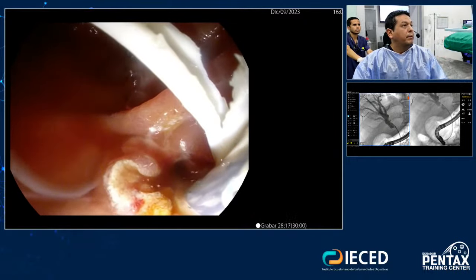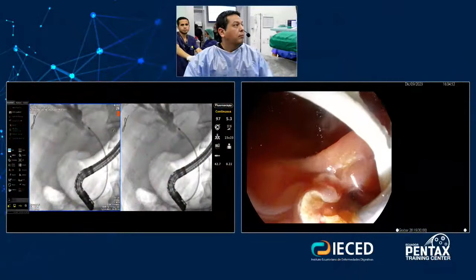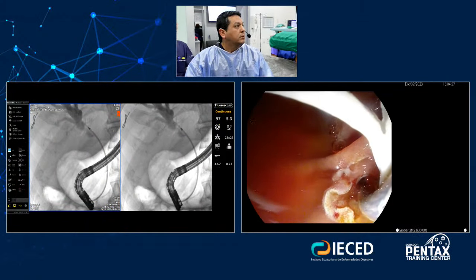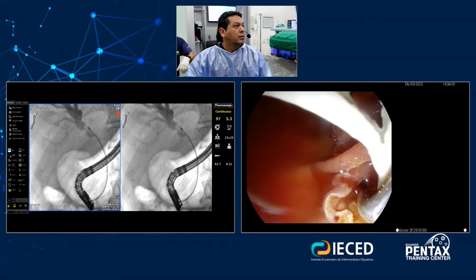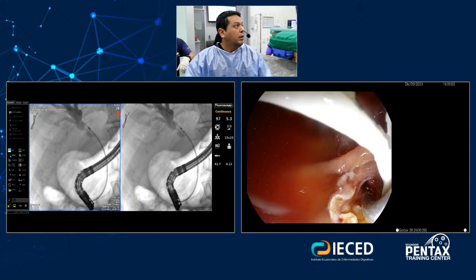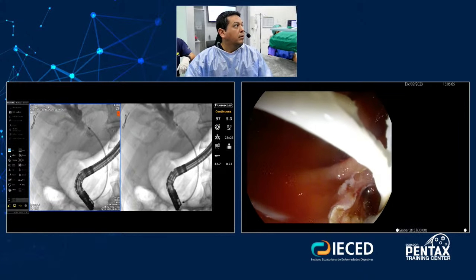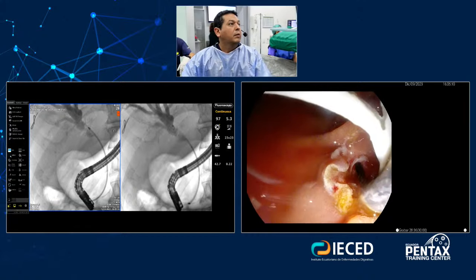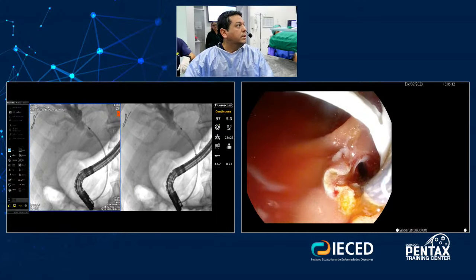So now you can start to open. I'm in a very good position now. Abre. Cuidado. Sigue.